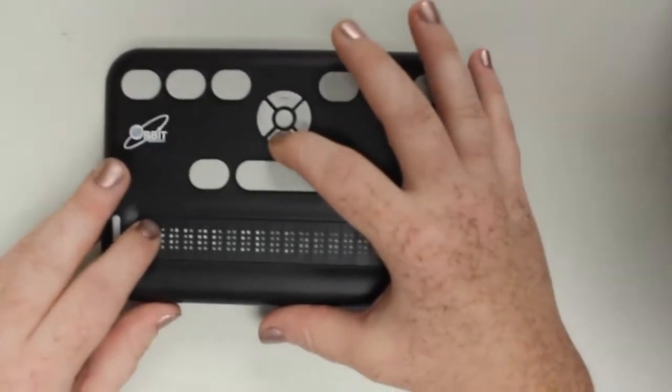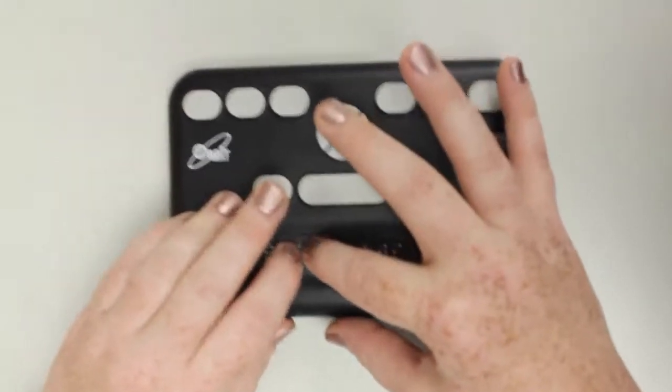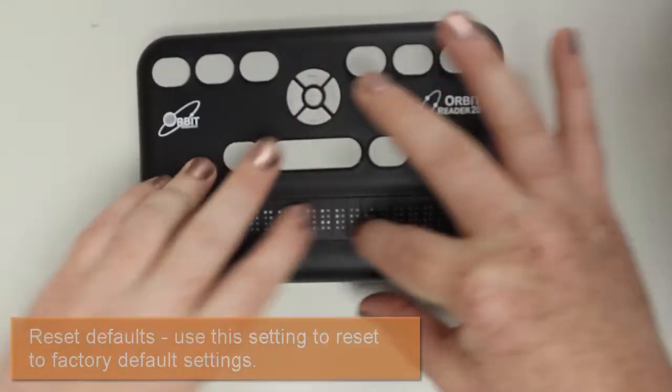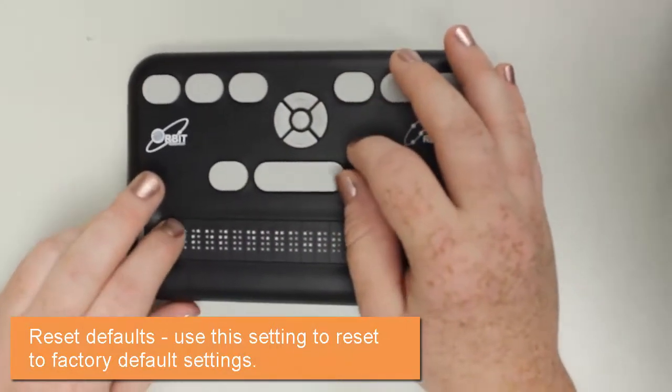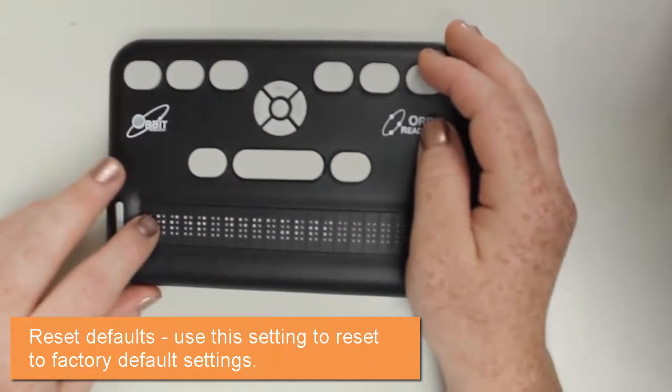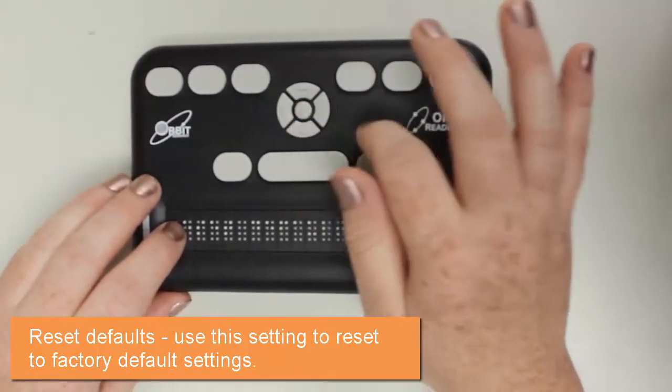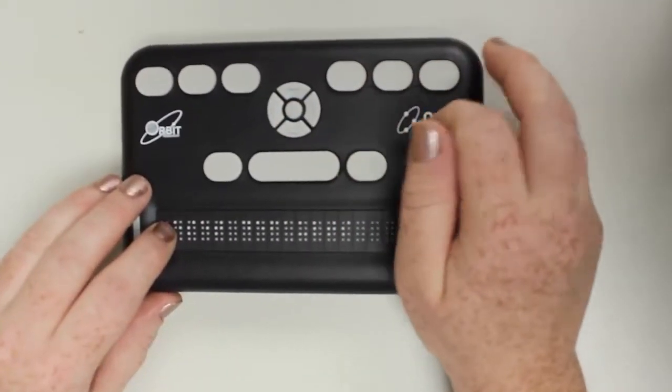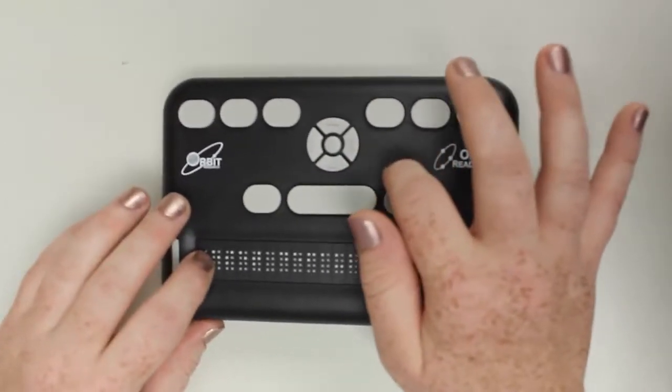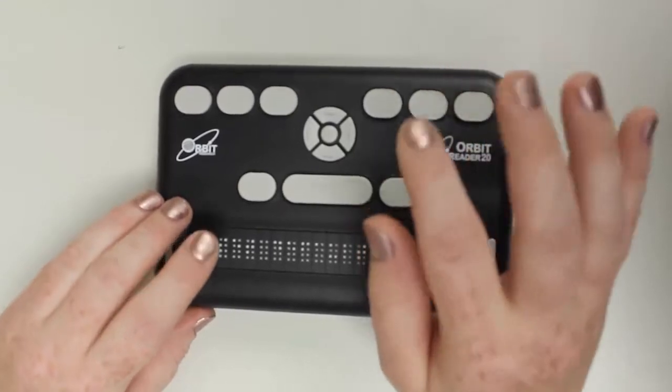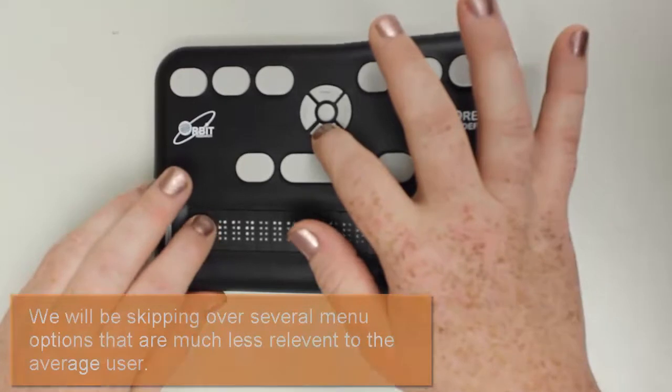The next option is reset defaults. Suppose you make a bunch of changes in your menus and you're not even sure what happened. You can reset the defaults, and I'm not going to do that because I don't want to, but you would just hit the select and any defaults like your language and stuff like that would be just reset. That's a nice option and a nice feature.